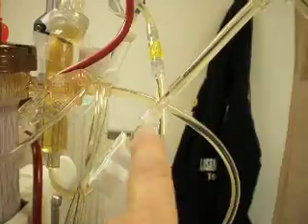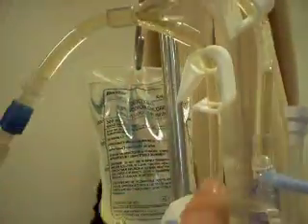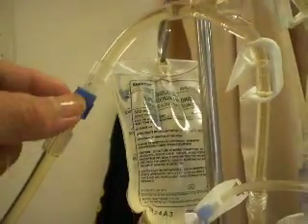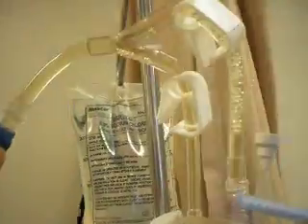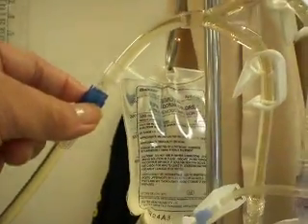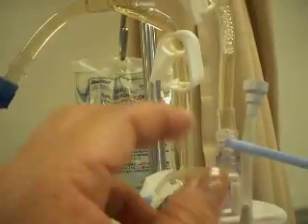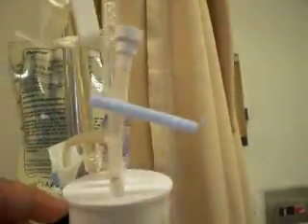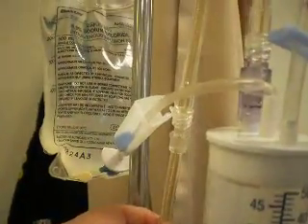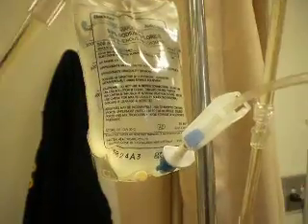We'll see the line end where patient's plasma has been drained and it's disconnected into a Y connector. This Y connector has to have one end as a female connection, and the other two ends have to be a male end — otherwise it won't fit into the micro-drip set.